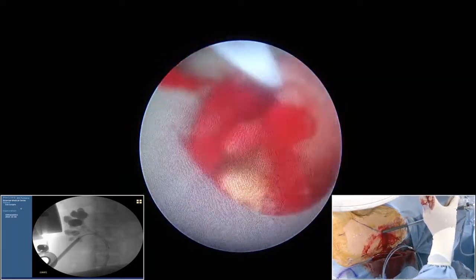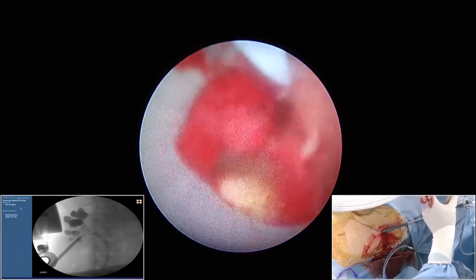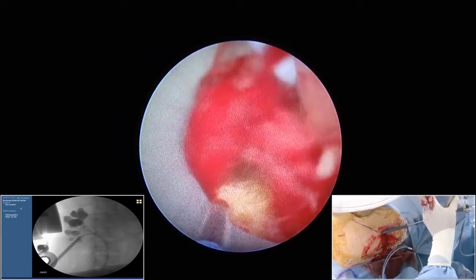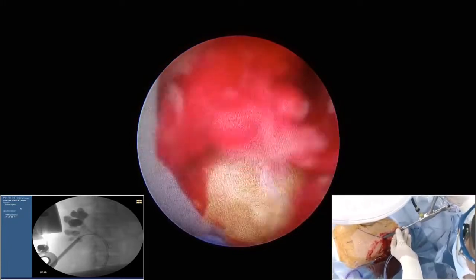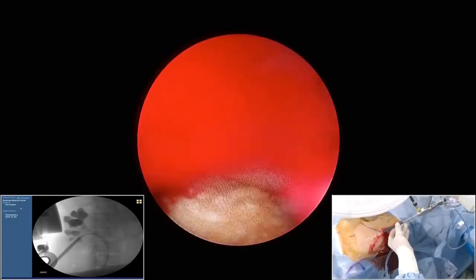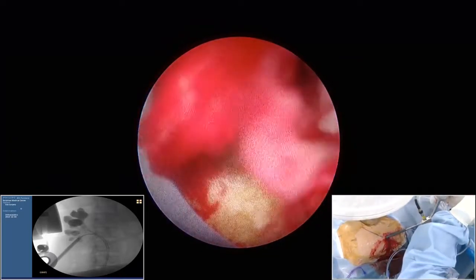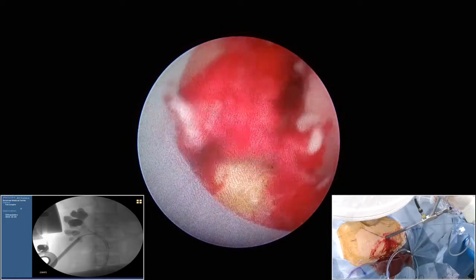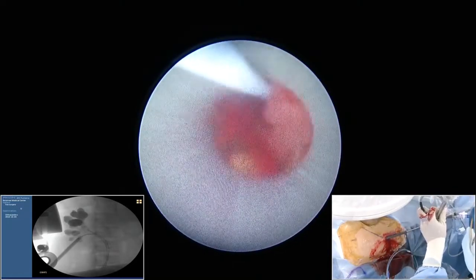This is available for medium-sized mini Perc from 15 to 18. I think that if we want to guarantee the surgical efficiency, a 550 is appropriate. So give me the pedal. Please check the laser setting. Now I'll use the 2.0 joule with 30 Hertz. Ready.